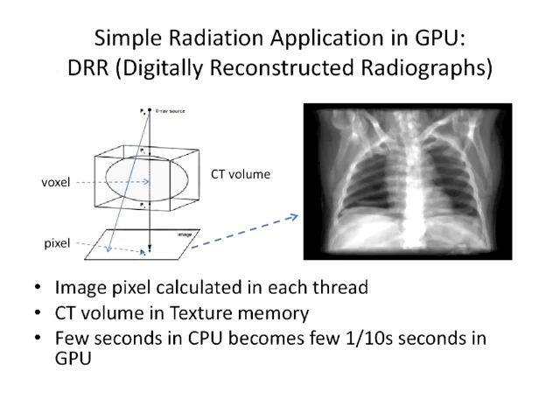So this one is an embarrassingly parallel problem, which was a perfect application for using GPU. Of course, you can do the same with MPI, using many nodes to get similar parallel performance. Compared to that, with one GPU we got impressive performance in the GPU application we developed.